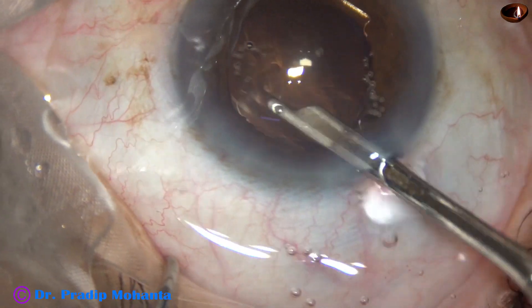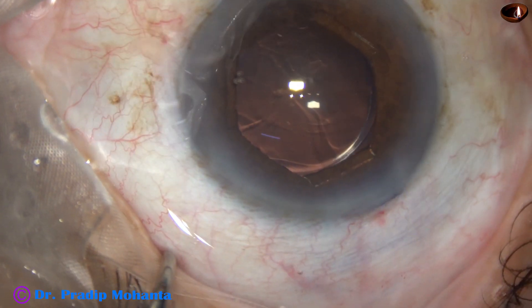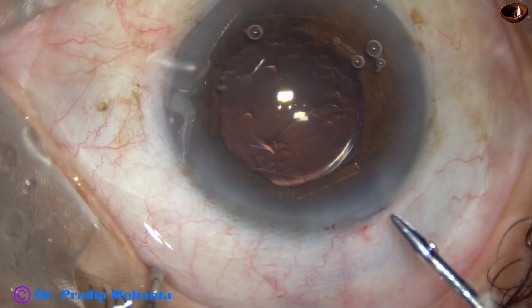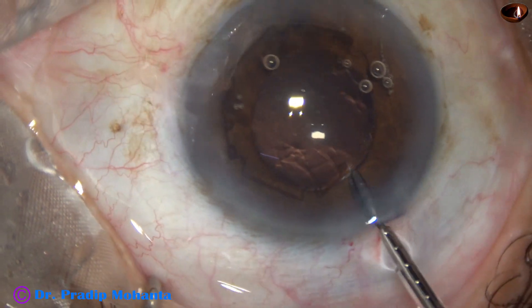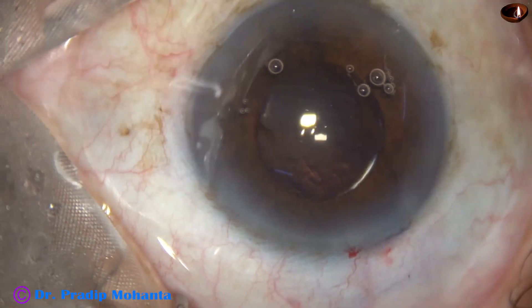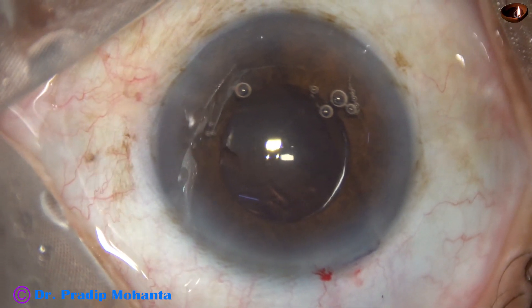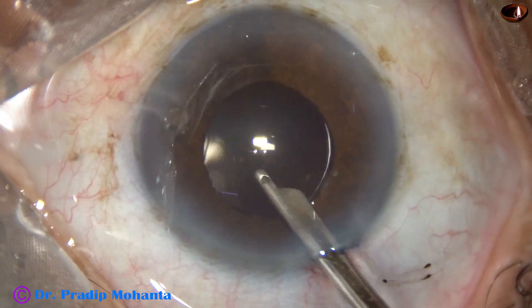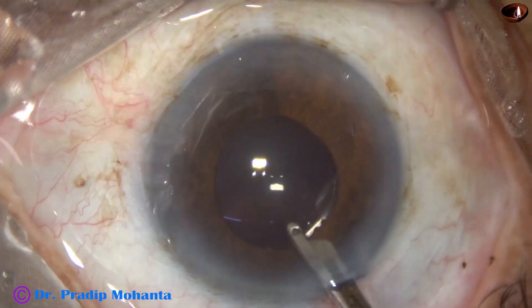And now it is time to clean the viscoelastic nicely. I spend a lot of time here — first with Simcoe, then with bi-manual irrigation aspiration. I did make a mistake here: before removing the pupil expansion ring, I started cleaning the visco. So to correct the mistake, I had to inject visco again and remove the ring. Now again I start cleaning the visco — irrigating the anterior chamber, going behind the lens, and irrigating the capsular bag.